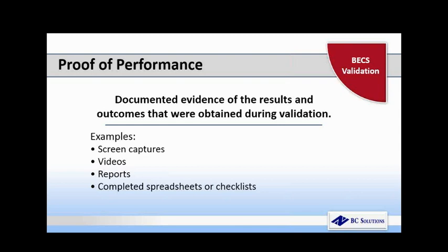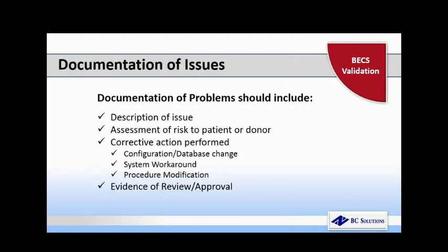Checklists or completed spreadsheets may be adequate proof of performance if whatever you're validating would just require observable evidence, an observation that you have made. Next slide, please.